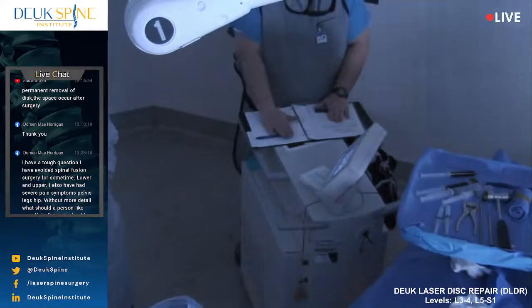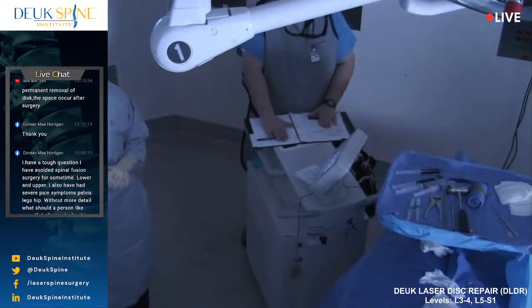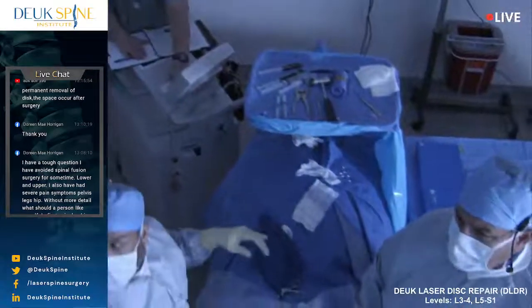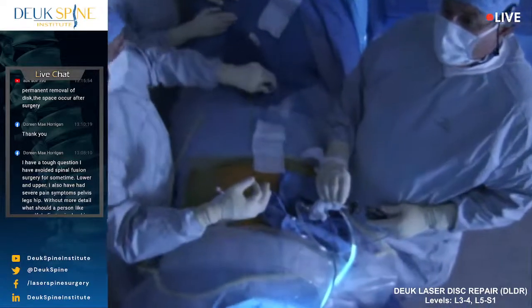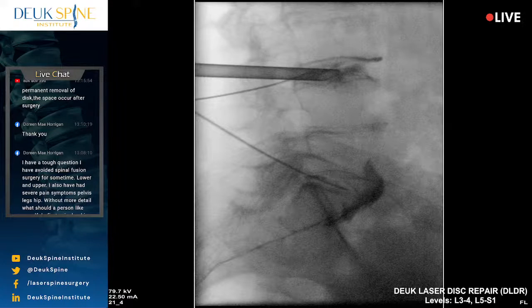And it generates anywhere from 10 to 100 watts of energy per burst of laser energy, per burst. And I'm just taking those bursts and directing them from that machine, I'm transmitting that energy along this glass fiber all the way down into the disc. And not the whole disc. I'm not bombarding the entire disc with laser energy. Literally, the energy leaves this 0.5 millimeter wide tube and it goes out 0.5 millimeter. So it's a 0.5 millimeter by a 0.5 millimeter pulse of energy. Every time you hear the pulse, and it's at what, 15 hertz? Is it 15 hertz? 15 pulses per second. 15 hertz.